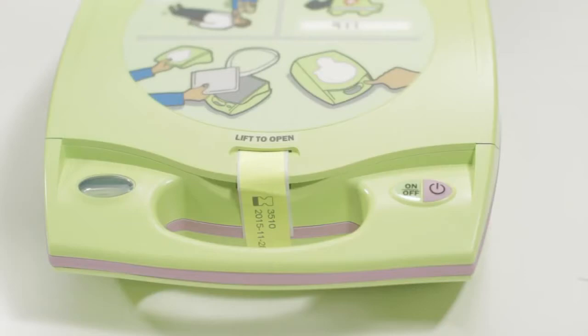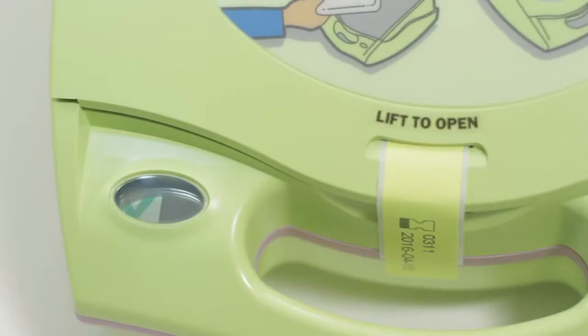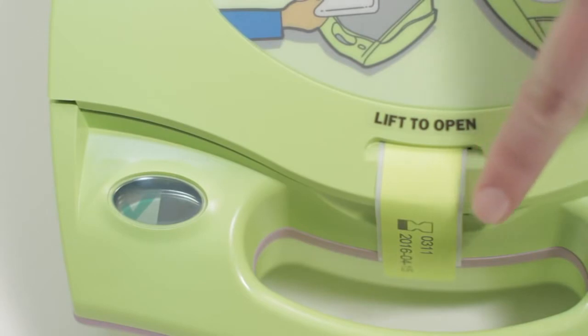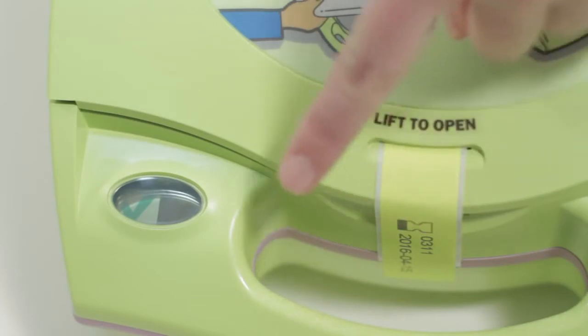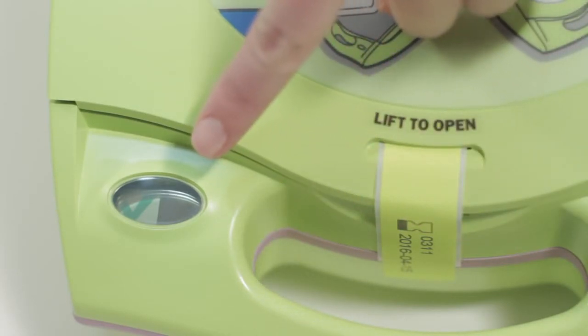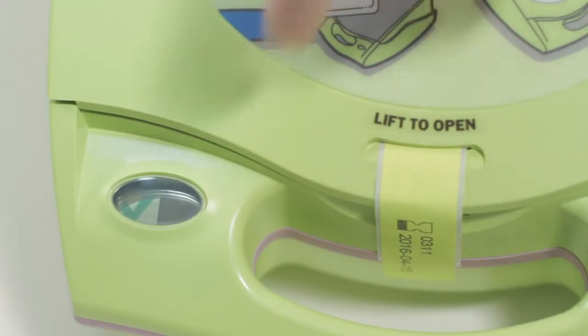Here's how to inspect your AED Plus in the future. First, check the expiration date of your pads, as indicated on the green tab, making certain this date is more than 60 days in the future. If not, it's time to order new pads. Next, check the status display window. It will display a green check mark if your AED Plus passed its last self-test.